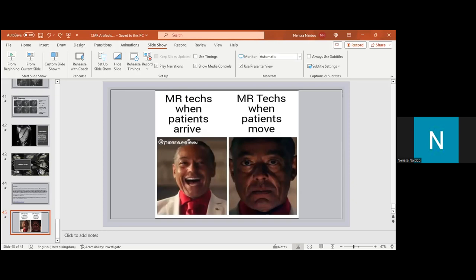Harrison, does that answer your question? Okay, so I just wanted to get a clear understanding. Is frequency shift actually an artifact or a means of correcting an artifact? It is an artifact that we usually find on a 3 Tesla. So if you are scanning on a 1.5T, then you wouldn't really experience it. Remember, the higher field strength causes more inhomogeneities. When your patient is lying in the magnet, that is when you get those frequency disturbances. So do you scan on a 1.5T or a 3T?